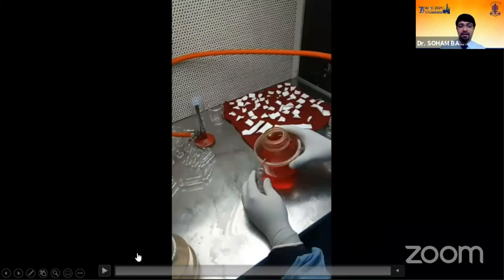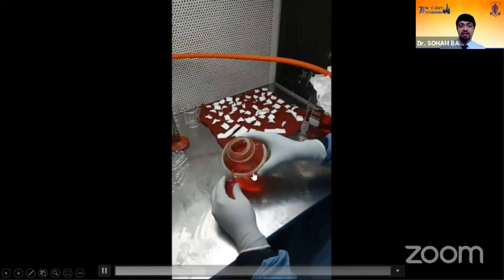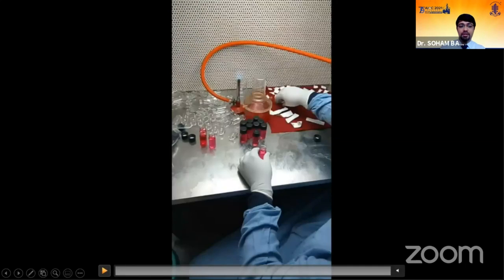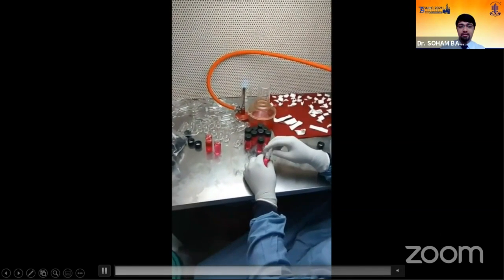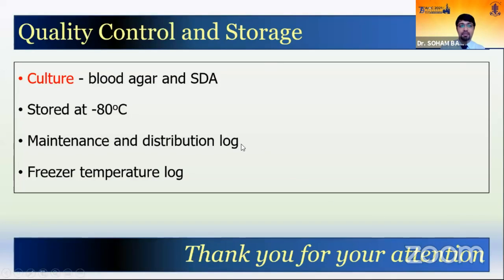After the strips are prepared, the culture media is bottled into sterile glass bottles. And then we put in the amniotic membrane individually. This is then sealed and labeled, and then finally stored at -80 Celsius.